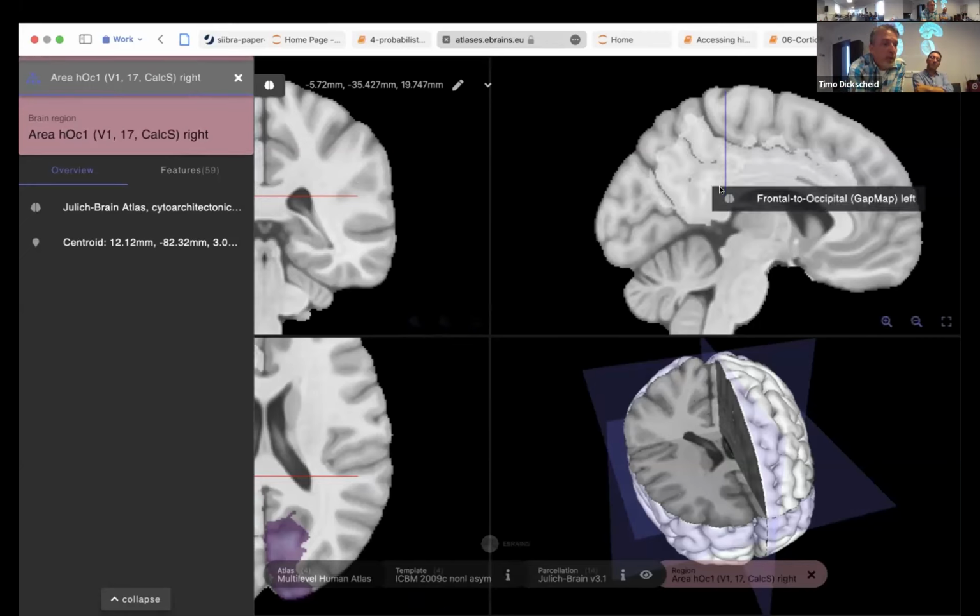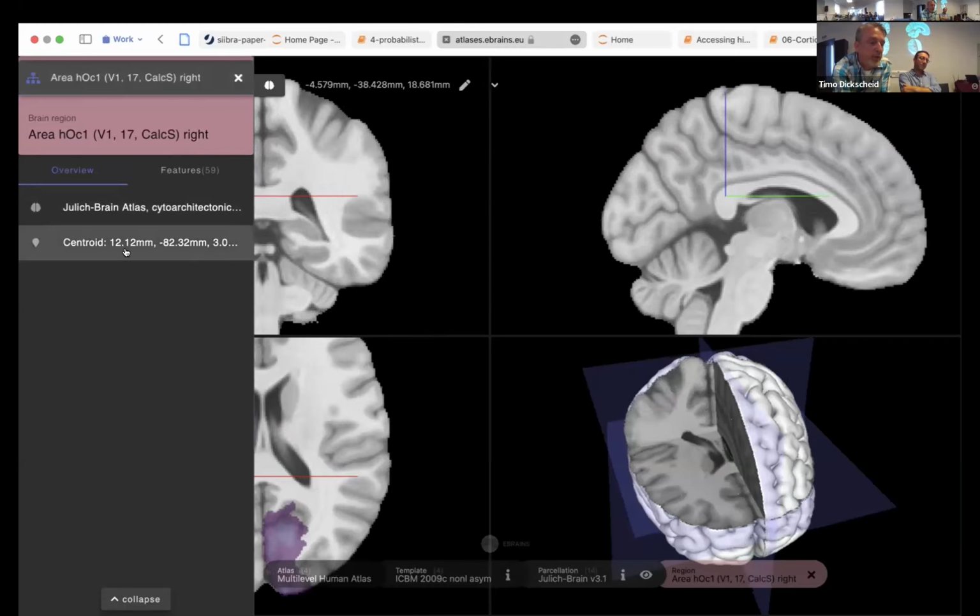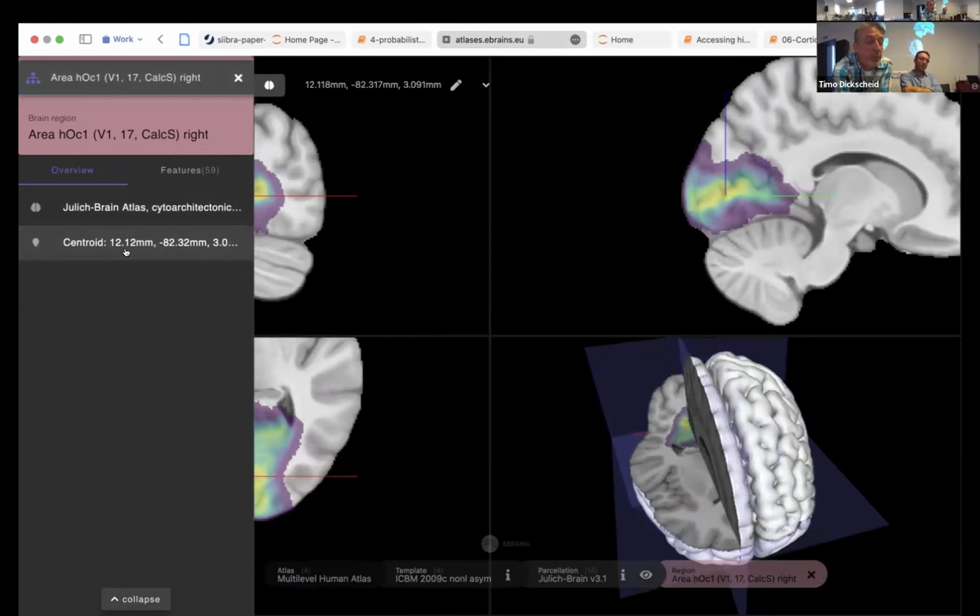So in general, here we have those 4 frames showing the individual maps or an overview of all maps of the selected data. And if you select something on the left side, you have this menu here giving you an overview about details and descriptions of the area you have selected. If you click centroid, it will bring you to the centroid of the area. Because sometimes if you have selected by the name, you do not directly see which map you have selected, therefore it's helpful.